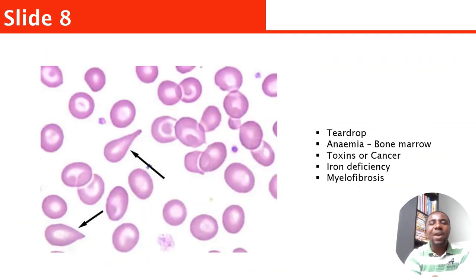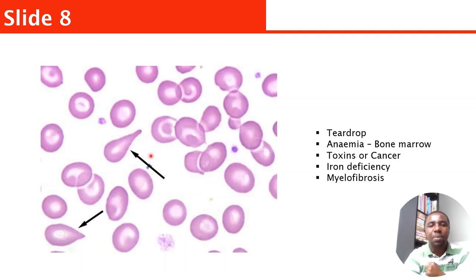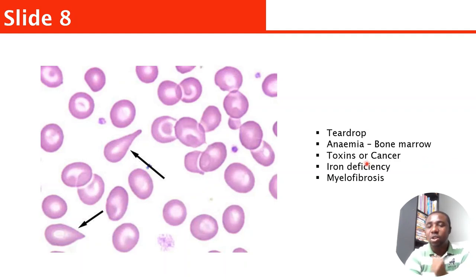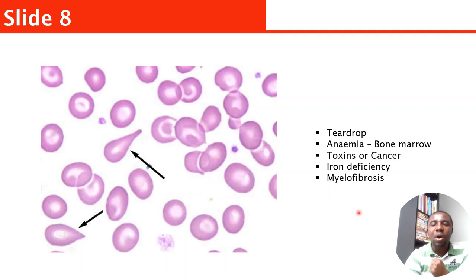Here is a typical example of teardrop cells. Teardrop cells can be seen in anemia which can be due to bone marrow infiltration, toxins, cancer, iron deficiency, or the bone marrow producing abnormal blood cells.